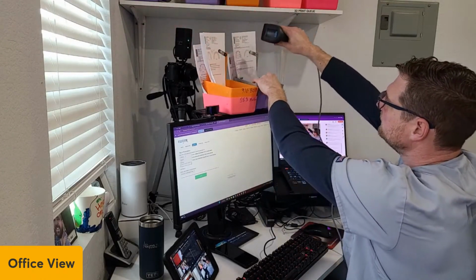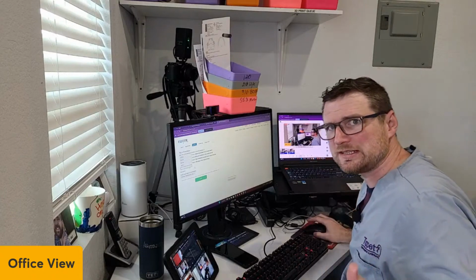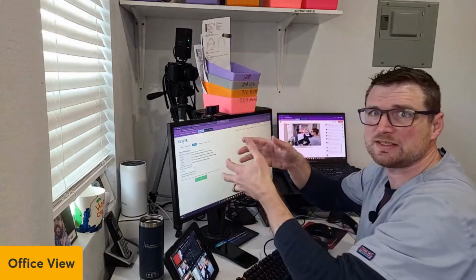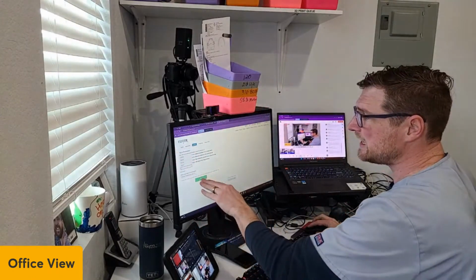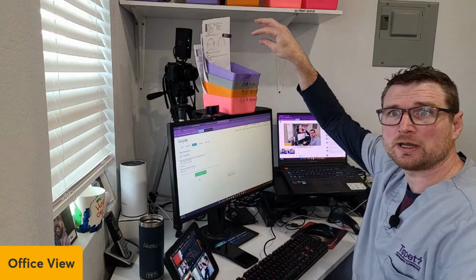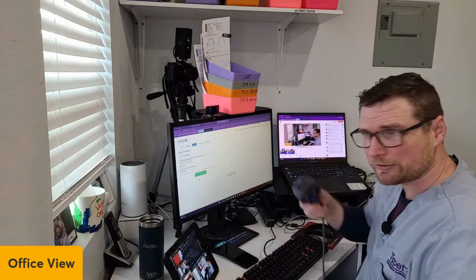Scan. You can scan those, and that's the same way you can check cases out, and so you can do bulk tags. If you've got a wire bender, he or she can have a stack of these and go to a station and check them all in as he or she bends, and then I can save it, and it adds all those tags in each individual EasyRx. So you don't have to go into each individual RX and add a tag. You can do it in bulk with a cheap $20, $30 scanner.